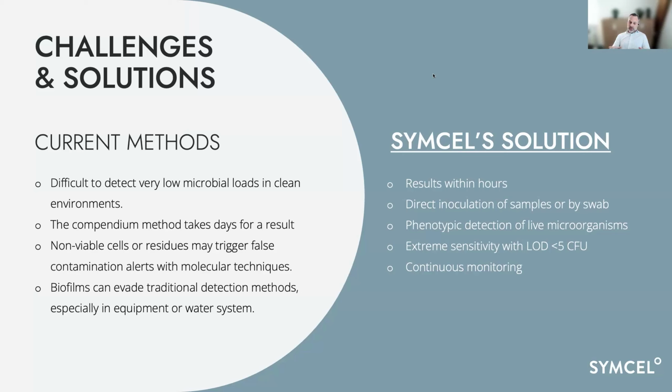The way this assay works is it has continuous monitoring of the samples, which means you get an alert right away when the system detects viable microbes. So it's not an endpoint assay where you look at the plates after a certain amount of time.